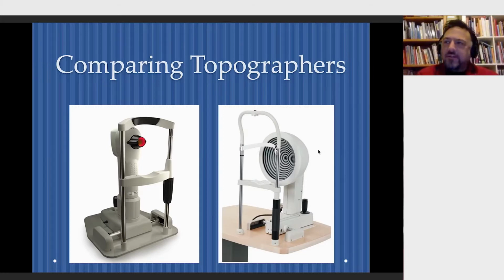Modern contact lens practice really is evolving, and the technology and the software that we're increasingly getting the opportunity to work with requires having high level diagnostic equipment in order to properly utilize this new technology for lens creation and design.